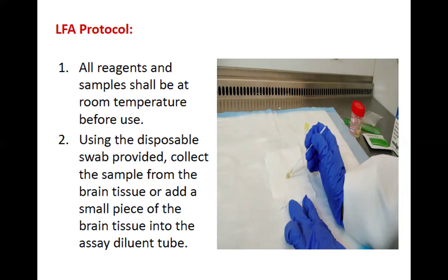If we just use a dropper to suck the sputum from the vials and directly put it on the sample pad before we put some buffers or any other chemicals, it seems that we don't have enough antigen. Okay, it seems that we don't have enough antigen because we can imagine that in the samples, we are not sure which part is highly concentrated with antigen.